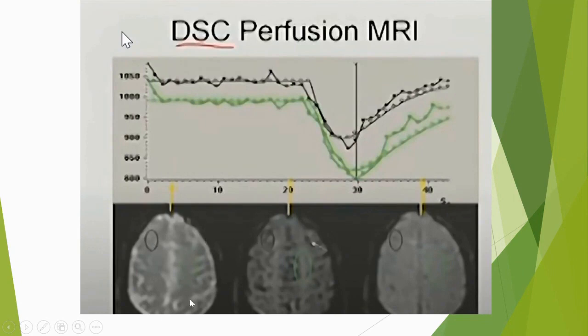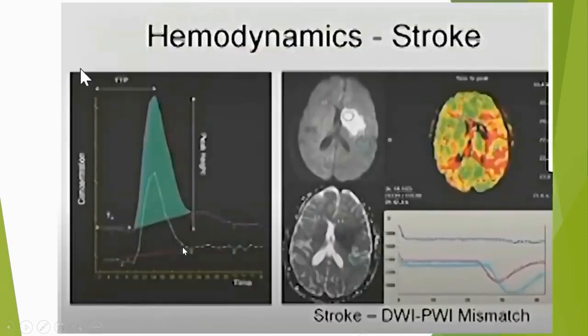Originally, it was not present. What happened to the signal in the two scenes? As you can see, and this shows the contrast. The same applies, for example, in a case of stroke, it provides a hyper signal in diffusion and gives a hypo signal in the ADC. So you want to see the perfusion or the hemodynamics present in the image in the area that is nourished concerning the contrast or the stroke.